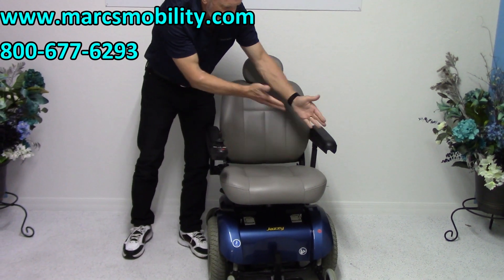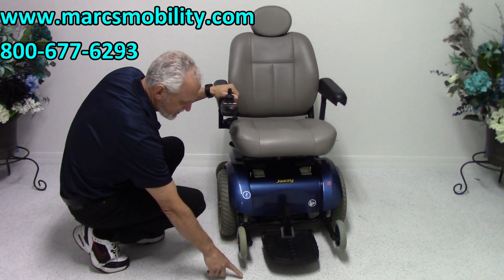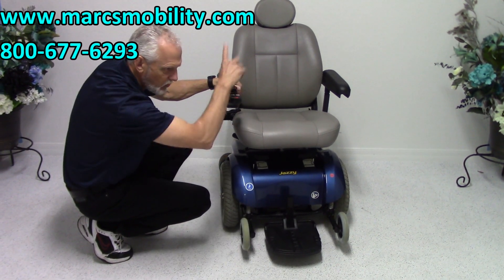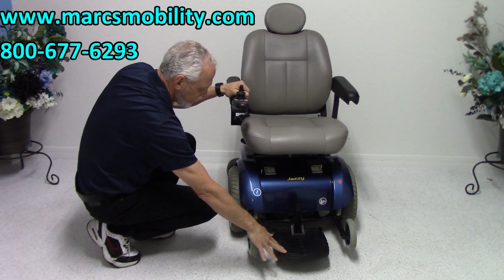The joystick is on the right, but we can easily put it on the left side with no problem at all. On this power chair, you have what's called an anti-tip wheel — they don't touch the ground, only if the chair leans forward will they keep the rear from coming forward. You have a foot plate that flips up when you get out, so you have practically nothing in your way.